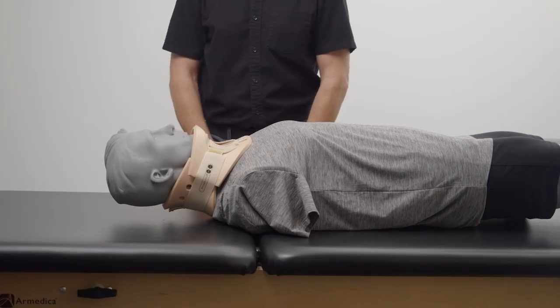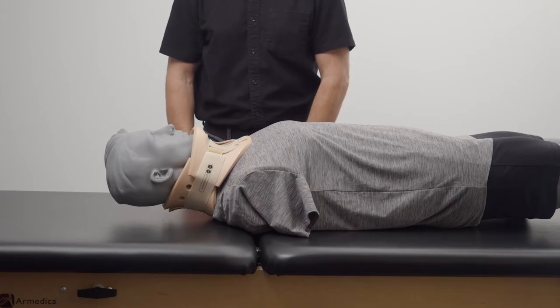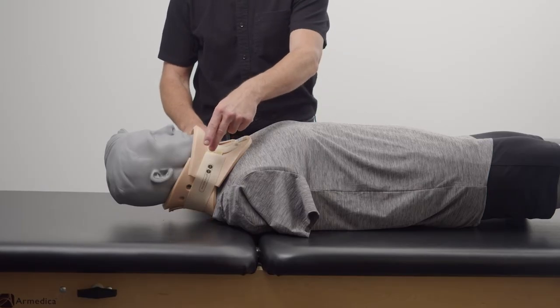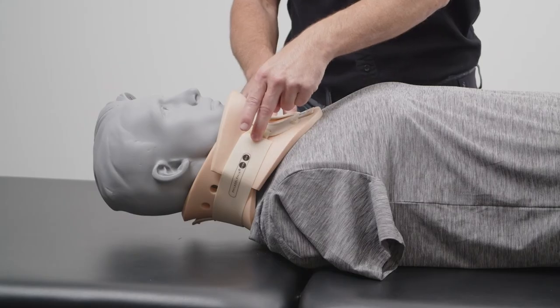It is important that the patient's skin condition is checked regularly every shift using correct hospital C-spine protocols. Before removing the collar, note where the ends of the hook and loop straps are. Try to make sure that you replace the straps to the same position.